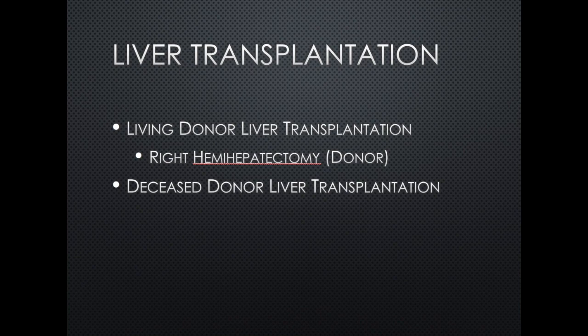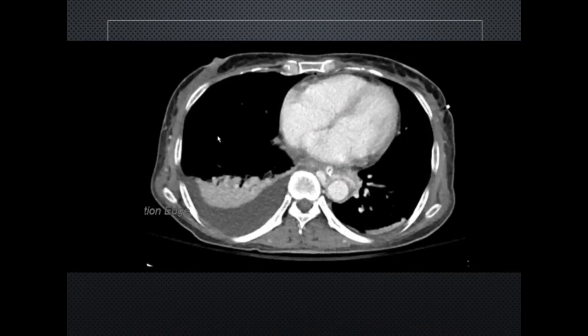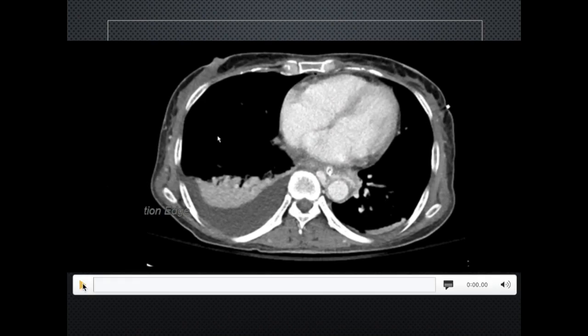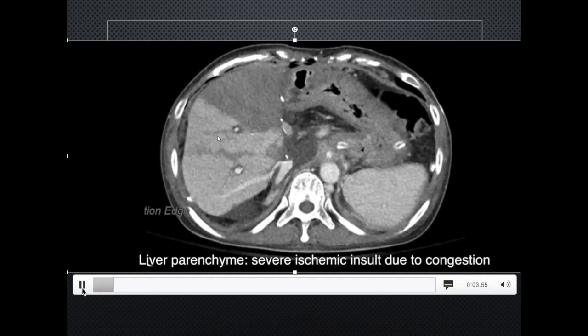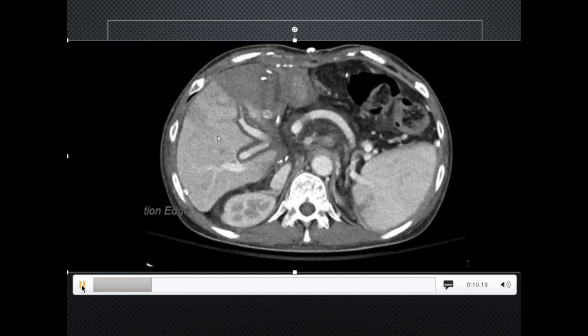Liver transplantation is one of the biggest hepatobiliary surgeries. For living donor transplantation, in our department we perform right liver resection. In both cases, all major vasculatures must be checked for patency, and the liver parenchyma must be given attention. This patient had living donor liver transplantation and took this CT scan after two days because her liver function tests kept escalating. As you can see, the liver parenchyma in the anterior section shows lower attenuation, suggesting ischemic change. There is also severe periportal edema.